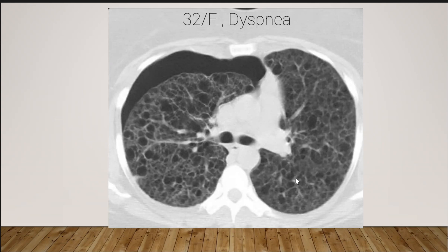As we see here, in LAM there are uniformly distributed thin-wall cysts, and these cysts are more or less the same size. It involves the costophrenic angle. However, in histiocytosis, the costophrenic angle is not involved, the cysts are irregular in size, and we see nodules. In histiocytosis, the cysts predominate in the upper lobes.